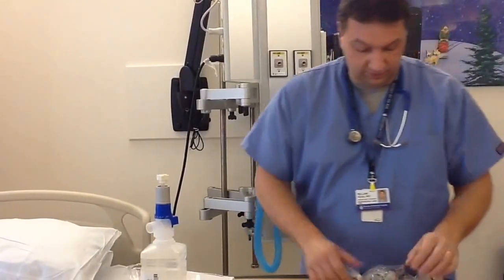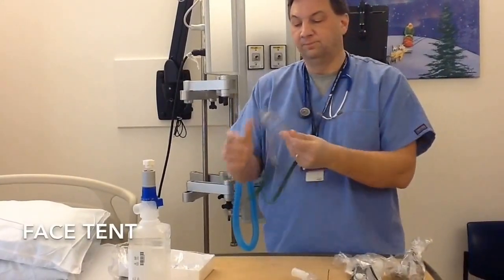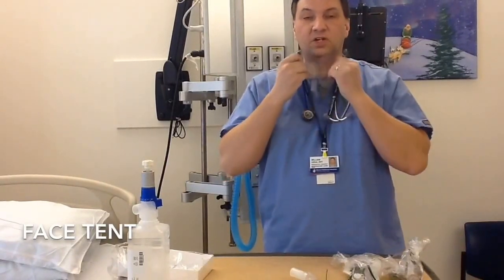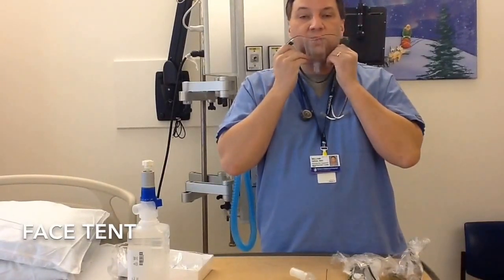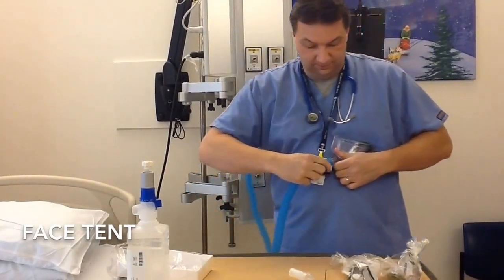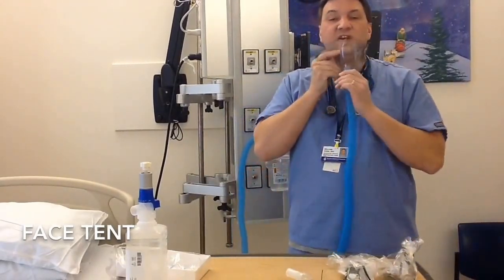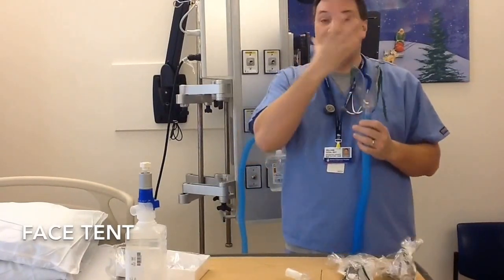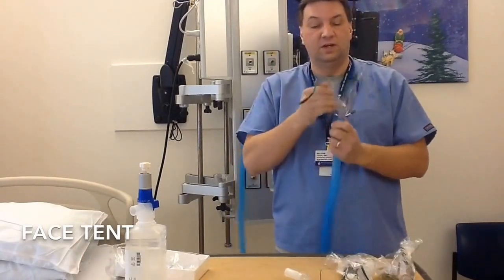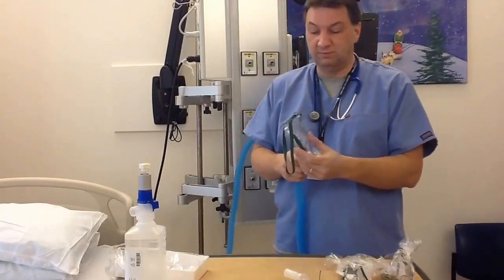Alright, so moving along to the devices, here is a face tent. This is used primarily on adult patients or larger pediatric patients, and what it does is it fits right underneath the chin, and we're able to go ahead and connect it just like that. And we're providing blow-by oxygen and humidification right under the chin, and the patient gets to breathe this in. This is great if the patient is claustrophobic and they don't like the mask around their face. This just sits nice under the chin, and it passively goes into the nose and mouth area.